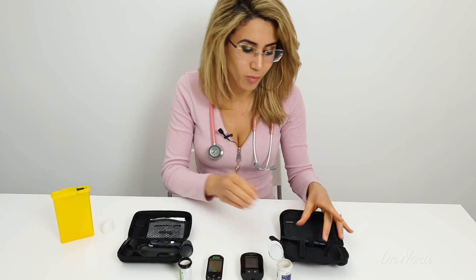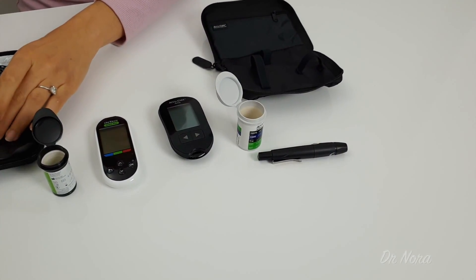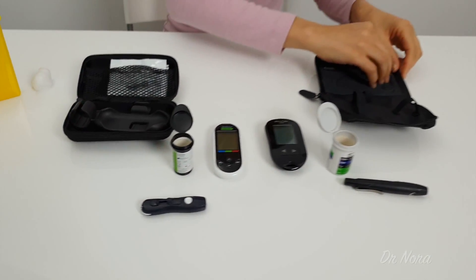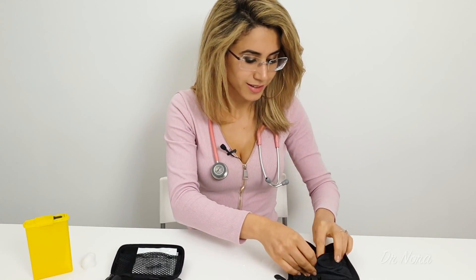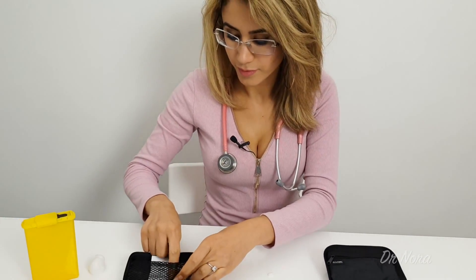Both of the devices will come with something called a lancet device and lancets, which essentially is another word for a needle. Whenever you are testing your sugar, it is always really important to have a sharps bin close by. This is one that you can get from the pharmacy or your doctor. You can fill this up and then give it back to your pharmacist once it is full. This will allow you to avoid any injuries to yourself or other people after you have used the needles.